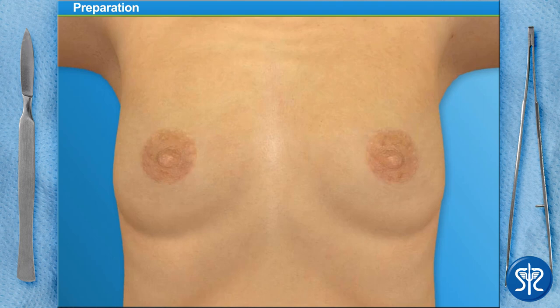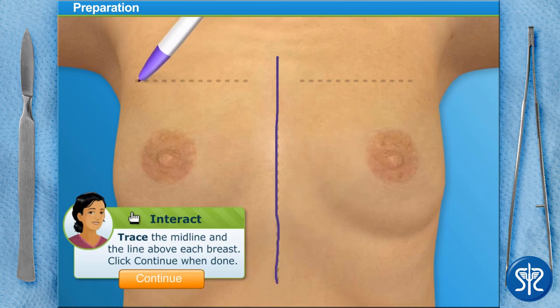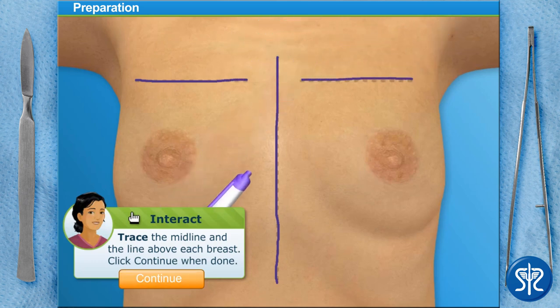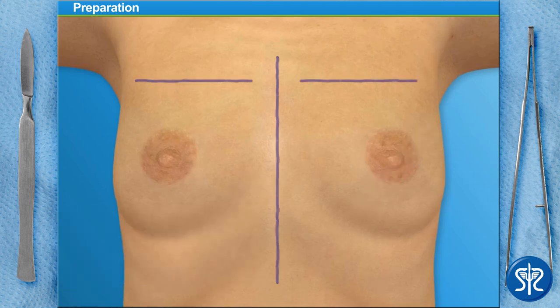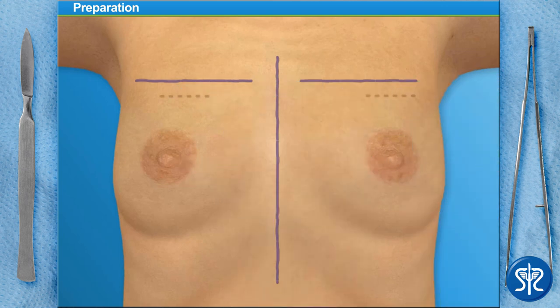In order to make sure each implant is in the correct position, we must first mark where the current top of the breast is and where the midline between the two breasts is as well. This will help us when we position the implant. I've marked each of these with a dotted line — can you draw them in with a marker? Now we need to measure the breast to decide where the top of the implant should go. We do this by measuring with a caliper from the middle of the areola. Draw with the marker at 12 centimeters to mark the top of the implant, then draw the outline of where the implants are going to be placed.